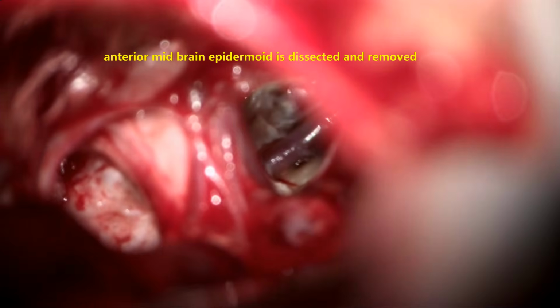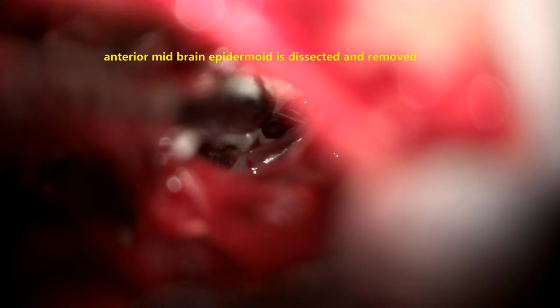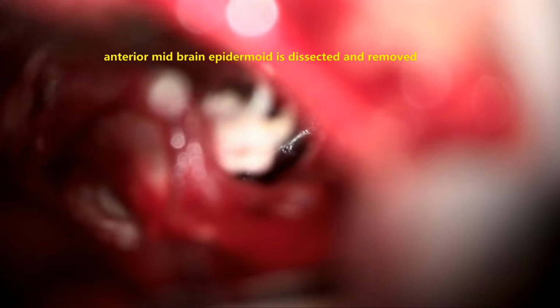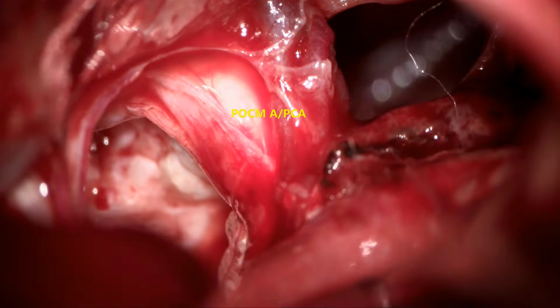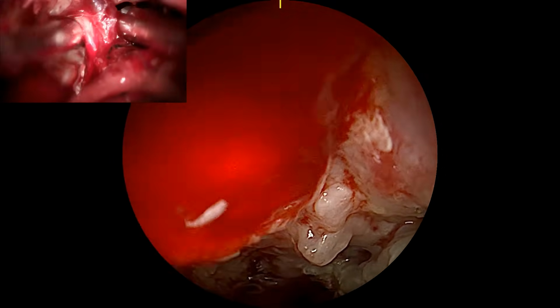Now the lesion around the 3rd nerve, posterior communicating artery and posterior cerebral artery is being removed with the help of microscope and taken out. This is the superior part of the tumor, anterior and superior to the trigeminal nerve. Now you can see the posterior communicating artery and posterior cerebral artery.